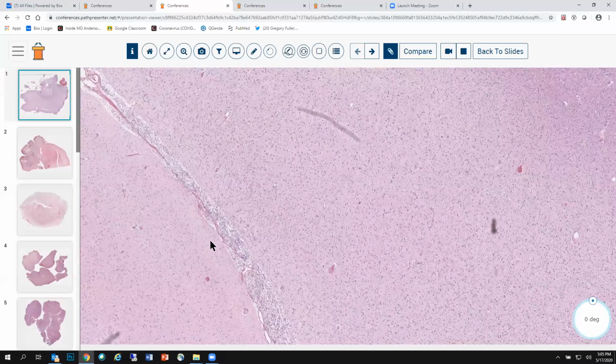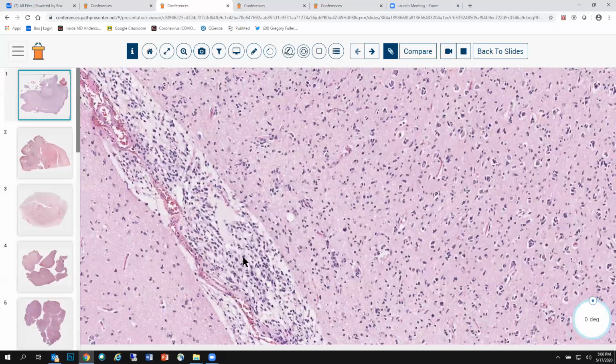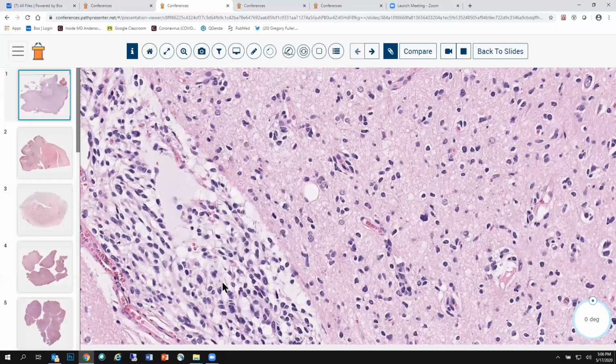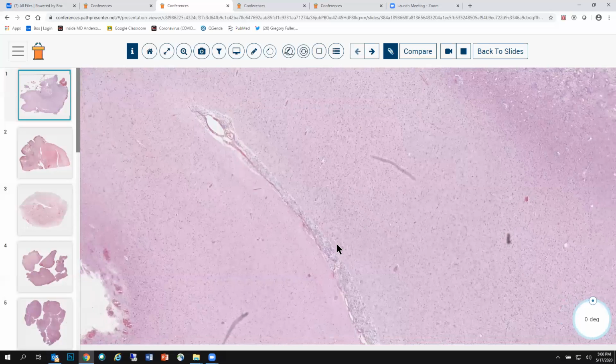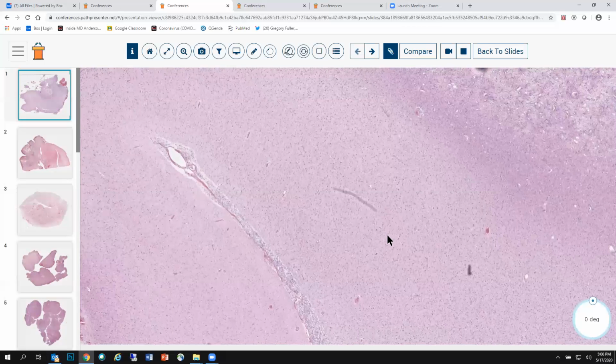And let's move all the way out to the pial surface. Here's a sulcus. And what you're seeing is this is actually an expanded subpial space, with the tumor cells infiltrating it, and they're in the molecular layer. That is a classic secondary structure of Scherer. So this is a diffuse glioma. The cytologic features are those of astrocytoma. We would have to confirm that, the differential being diffuse astrocytoma versus oligodendroglioma, with molecular testing.